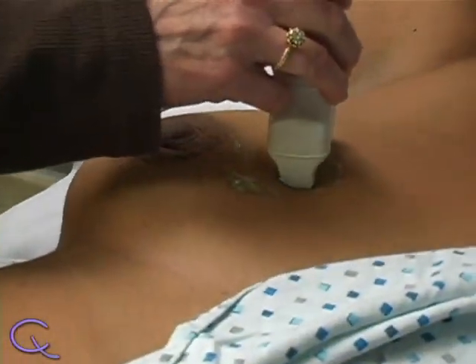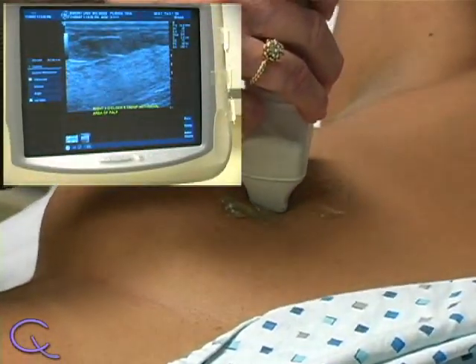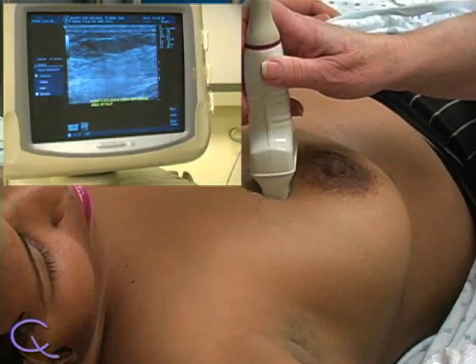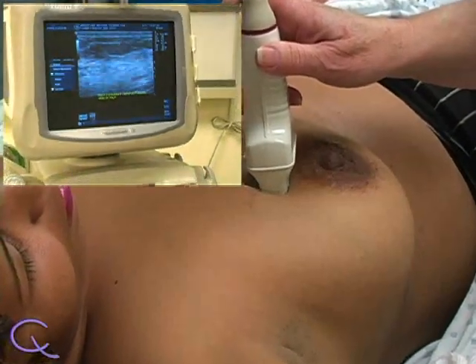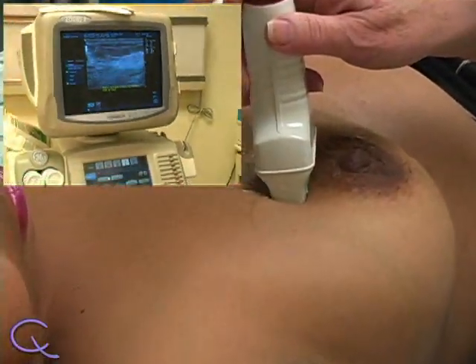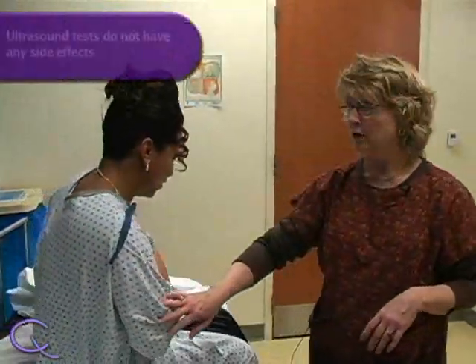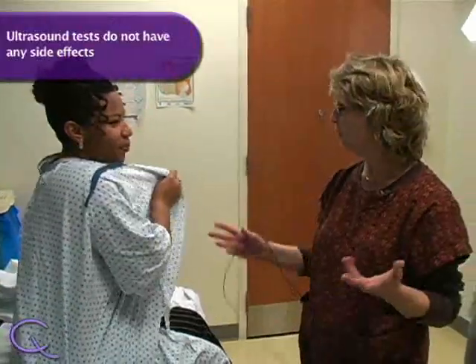During the exam, you may be able to see a screen displaying the images that your doctor will evaluate. Once the exam is over, you can remove the gel and resume your normal daily activities.